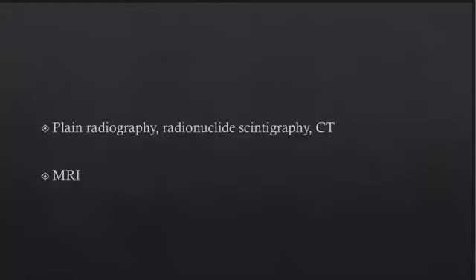So, we can consider that benign or malignant compression fractures of vertebral bodies may be a difficult diagnosis. Plain radiography, scintigraphy, and CT images are unsatisfactory and unreliable for differentiating benign from pathologic fractures. Thus, MRI is uniquely suited for assessment of bone marrow abnormalities of the spine.